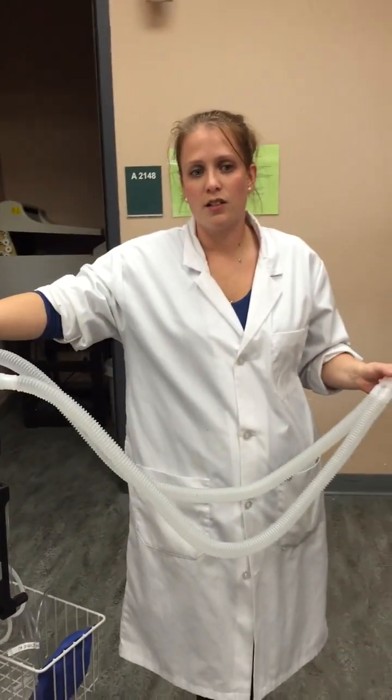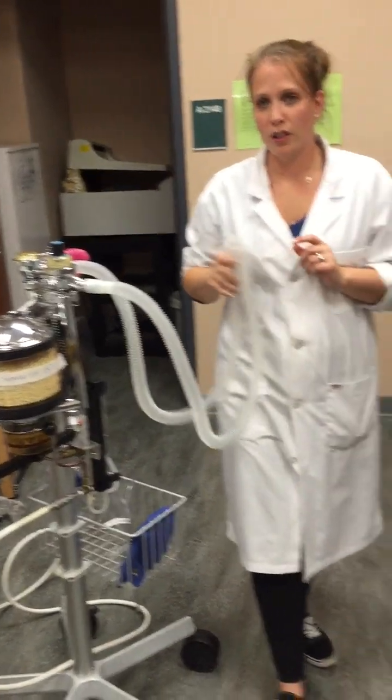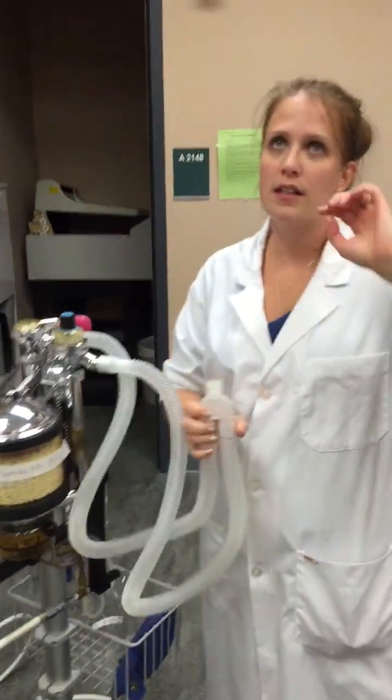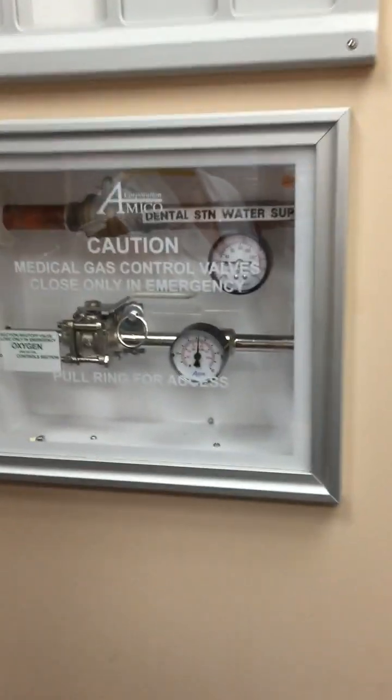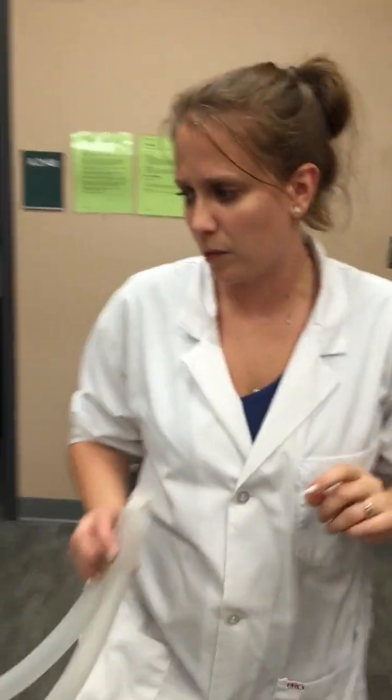Today we're going to be demonstrating the oxygen flow from the oxygen tanks through a rebreathing system. We're going to start with the oxygen supply tanks that are located in the radiography suite. From there, they go up through the wires and the cables through the ceiling to this oxygen reducing valve. The oxygen tanks start at 2000 psi. The reducing valve decreases it to 50 psi, a much safer pressure.